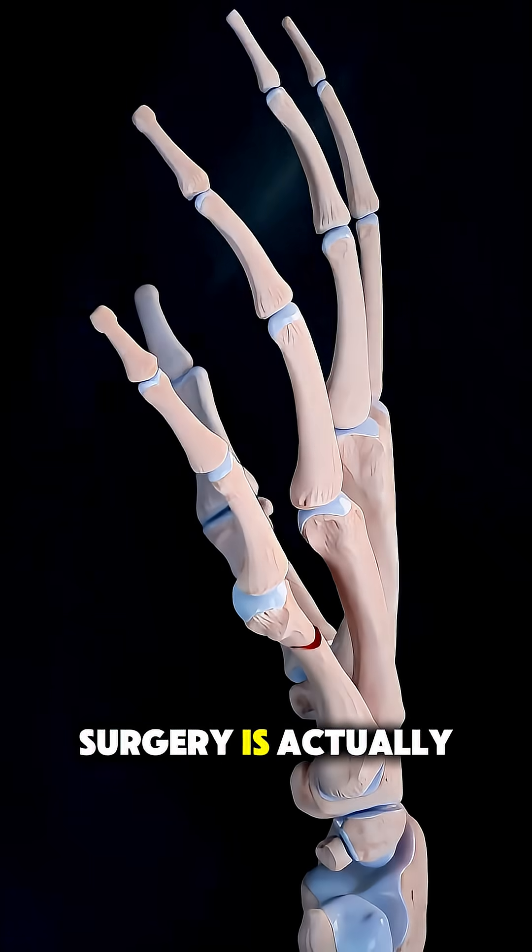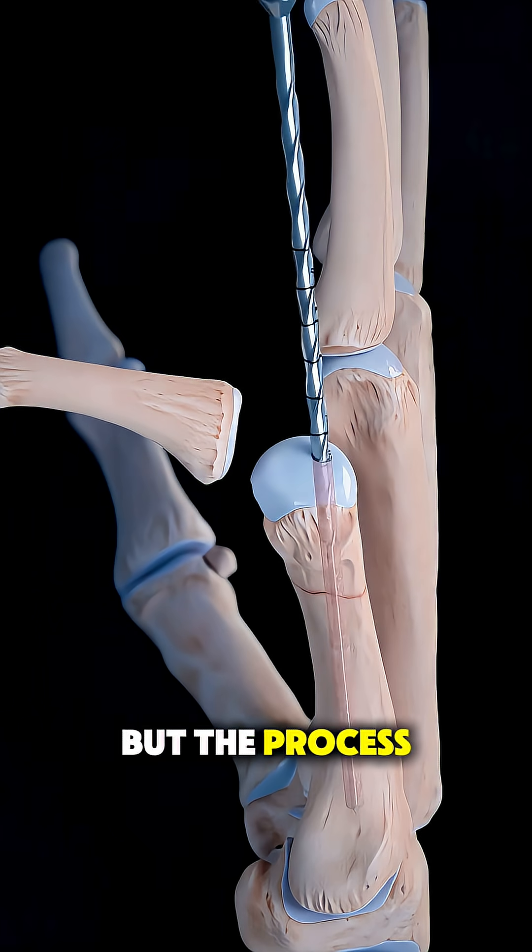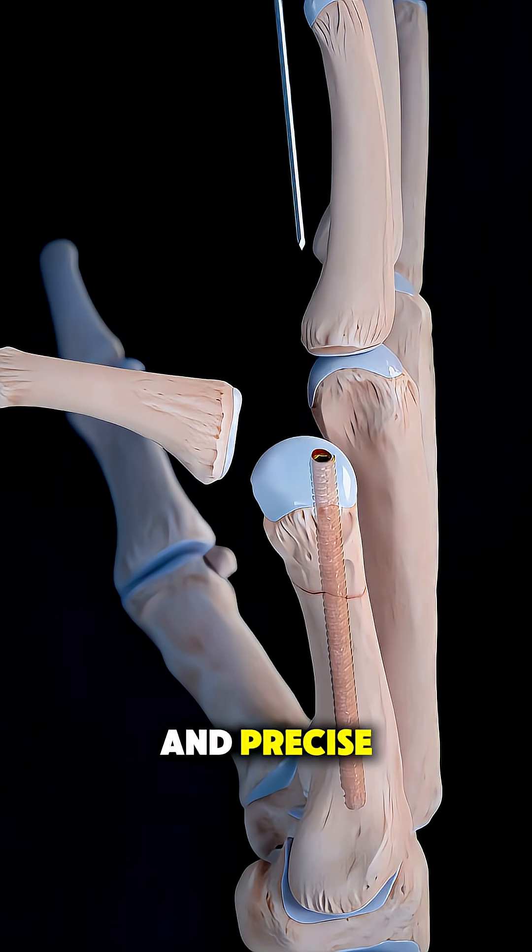Ever wonder how finger fracture surgery is actually performed? It might sound intense, but the process is surprisingly structured and precise.